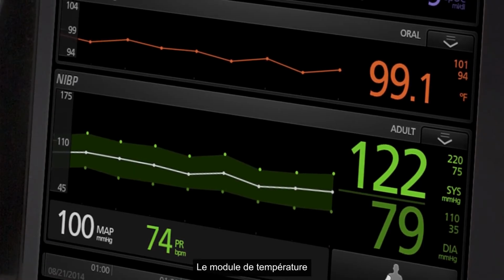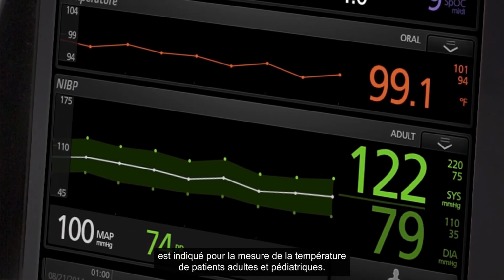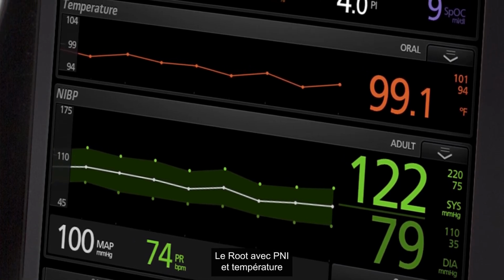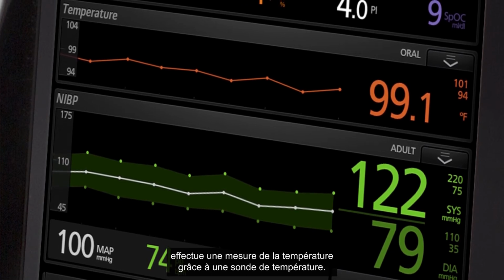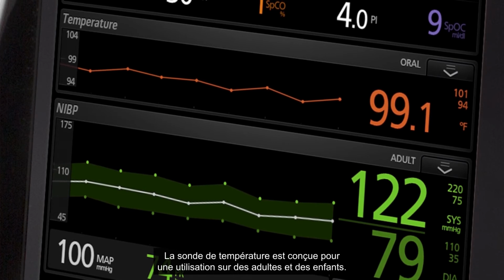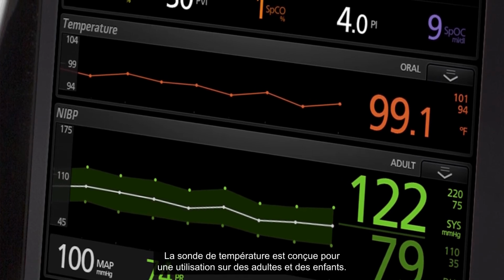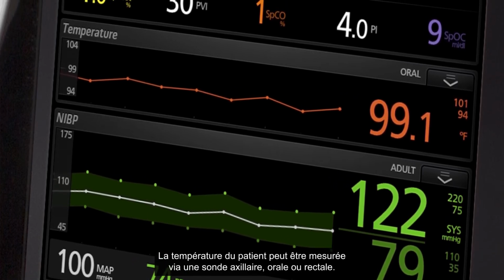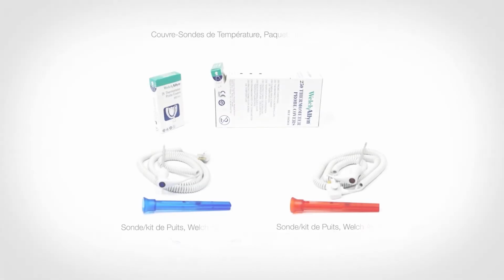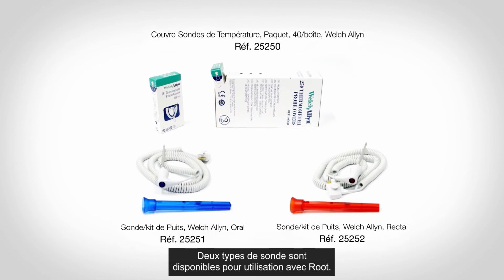The temperature module is indicated to measure temperature of adult and pediatric patients. Root with non-invasive blood pressure and temperature takes a temperature measurement through the use of a temperature probe. The temperature probe is designed for use on adult and pediatric patients. Patient temperature can be measured via an oral, axillary, or rectal probe. Two types of probes are available for use with Root: an oral, axillary probe, blue, and a rectal probe, red.